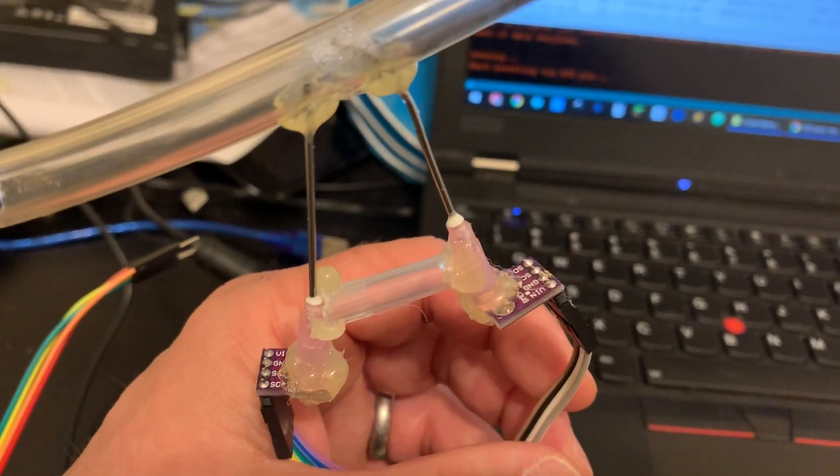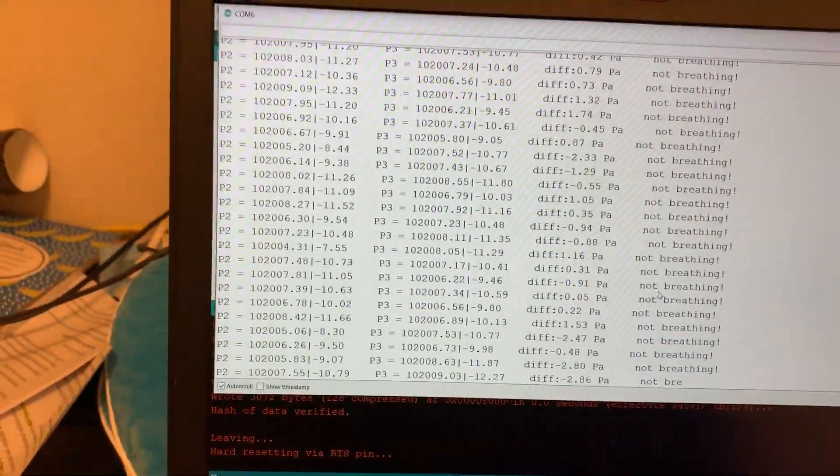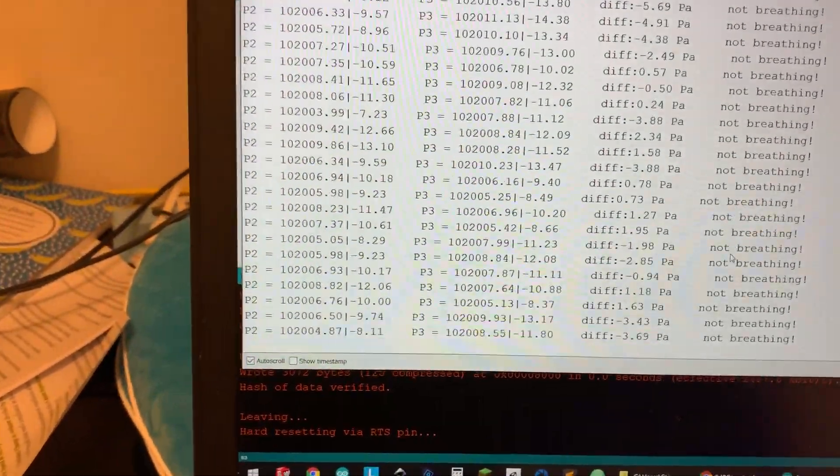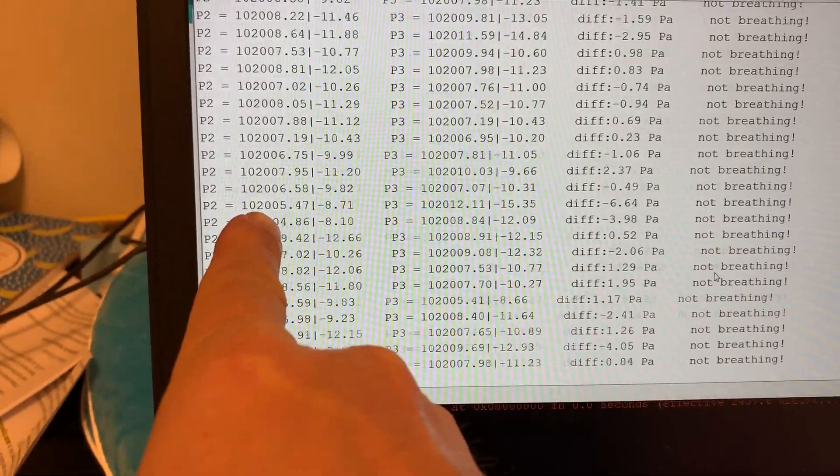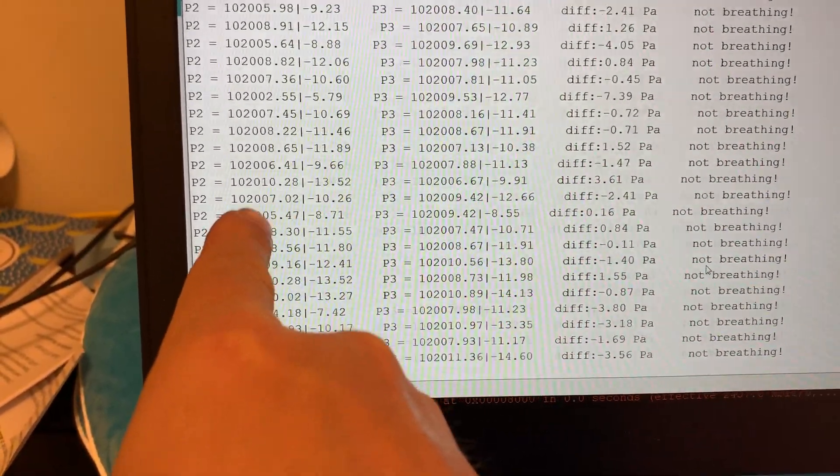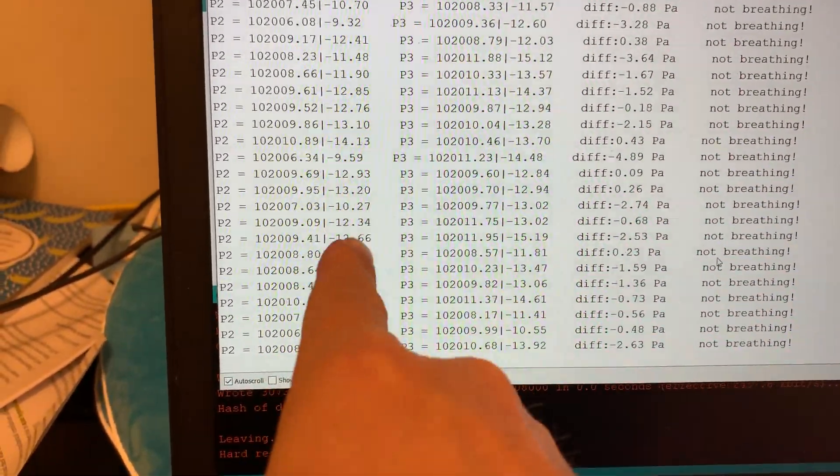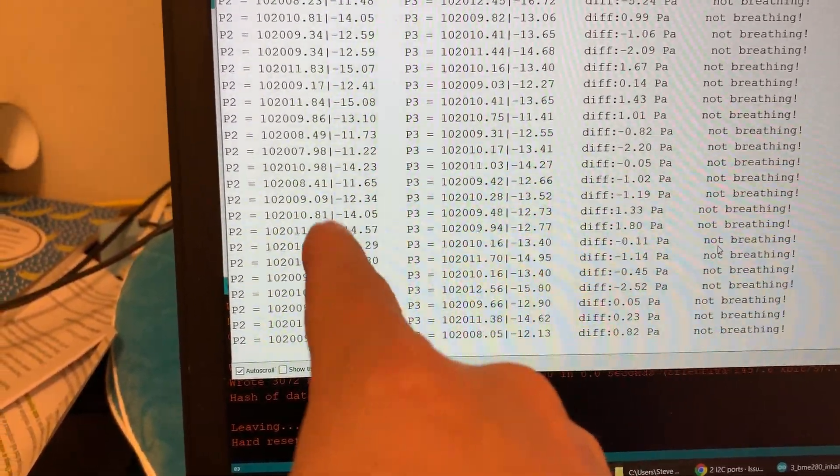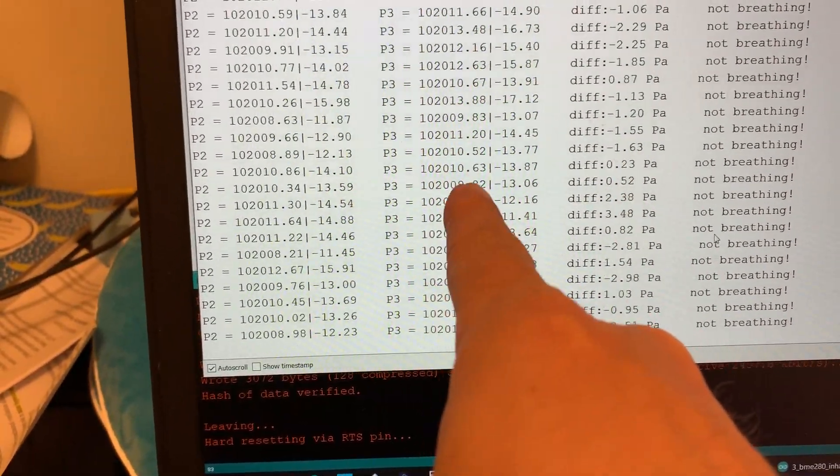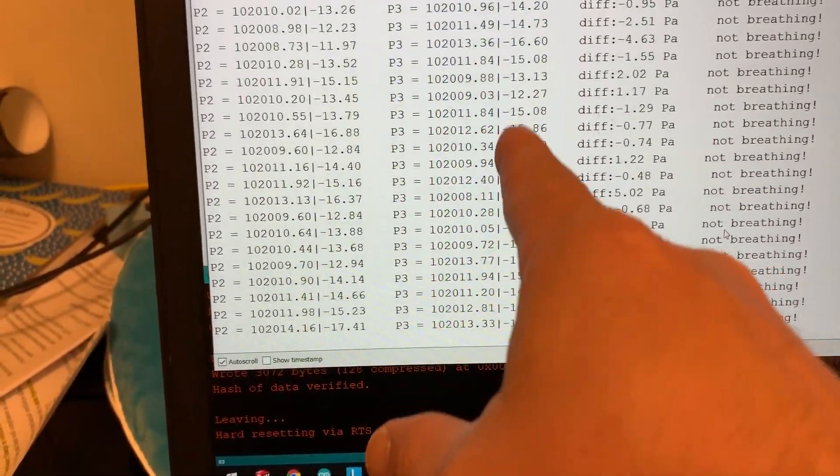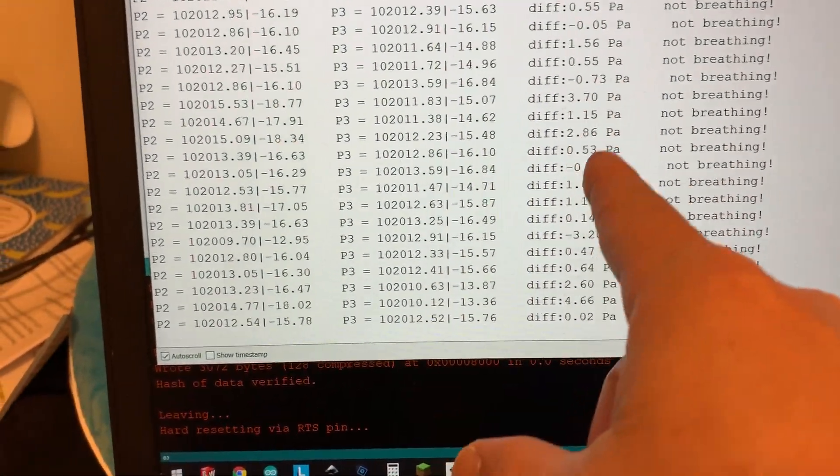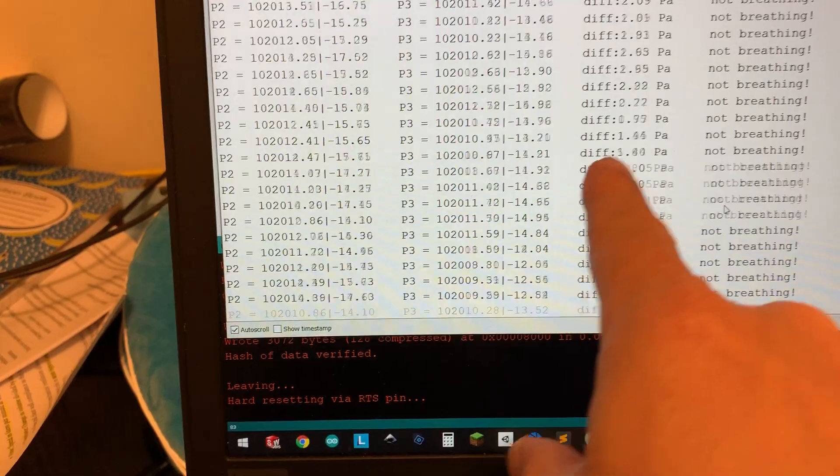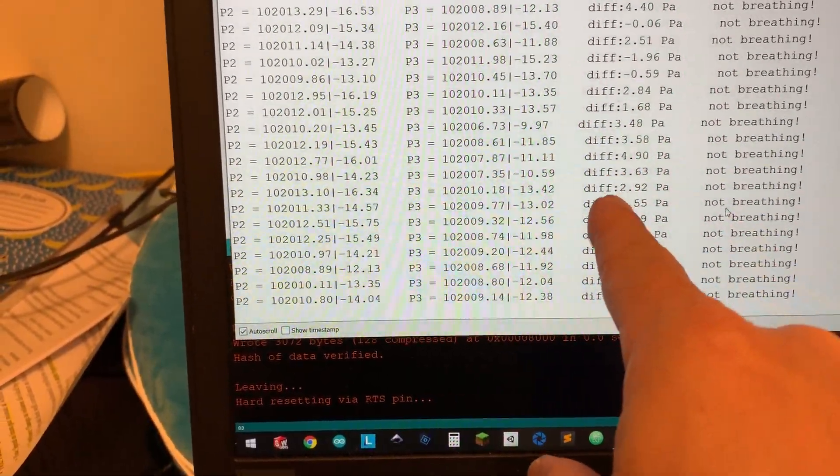And I have this just simply reporting to a serial monitor here. So as you can see here, this first column is showing the first pressure sensor, and then this is different from the ambient from when I booted. We're going to have a little bit of drift here. This is the second sensor, and then this is also different from the ambient. And then this third column is a difference between the two pressure gauges. This will allow us to calculate the speed.